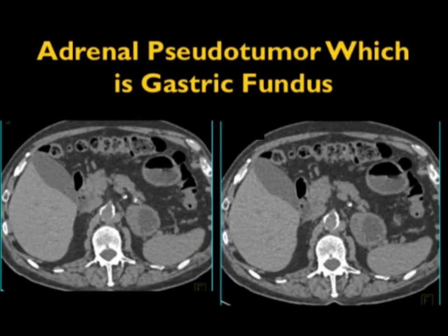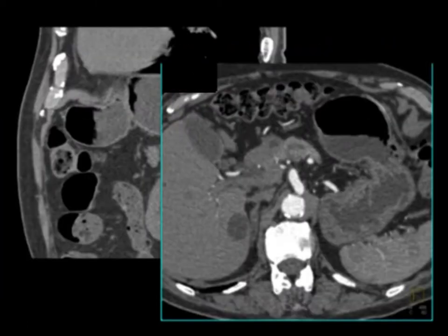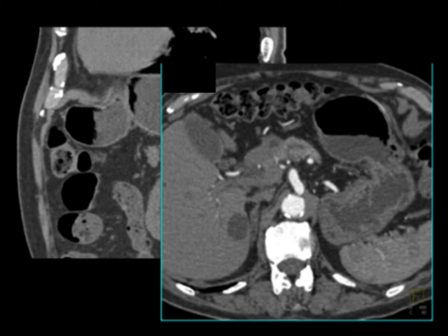When we look at CT, sometimes we can be fooled into calling something an unsuspected adrenal mass when it's not. When you look at this set of images, there appears to be a left adrenal lesion — but this was the last scan of a chest CT. With more sections, you would recognize that was the fundus of the stomach. Sometimes the fundus of the stomach, or diverticuli off the fundus, can simulate adrenal lesions. If you have the stomach distended with fluid, that won't be a problem.